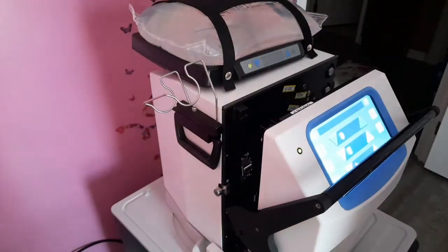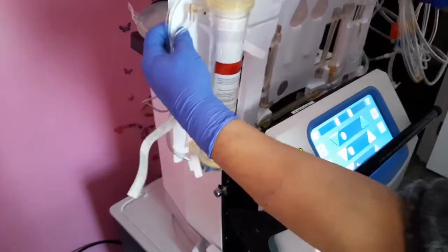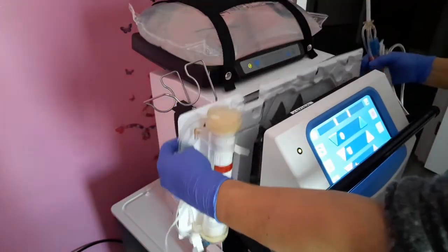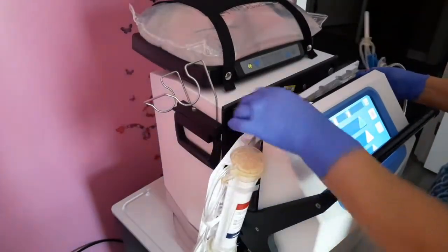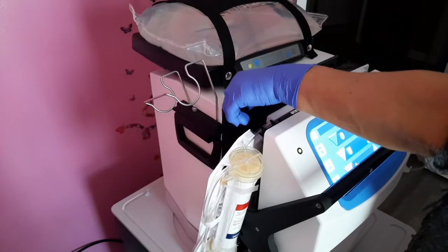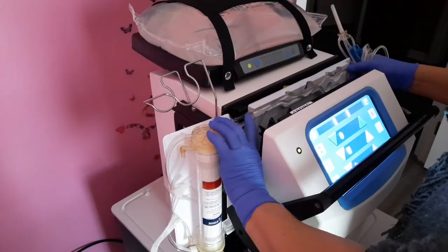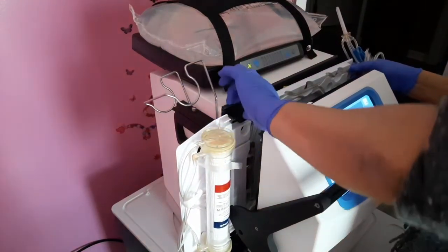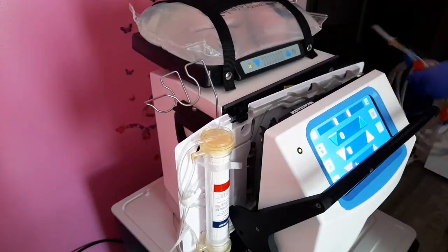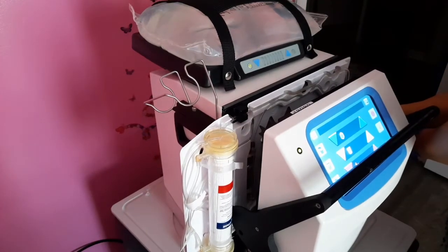Okay, so we're at the cycler. We're going to sit with the dialyzer on the outside, on the left. We're going to sit the cartridge in the cycler. Now, there's a little compartment here, a line holder. You want to attach that top line and sit it right in there, just push it in. And there's two more of these little locks on the right side. You just find them: there's one dead in the center on the right and then one at the bottom.